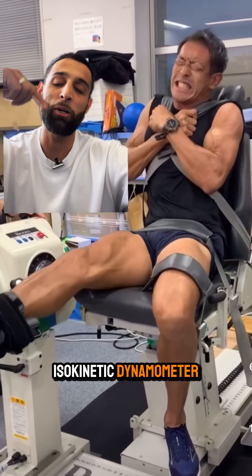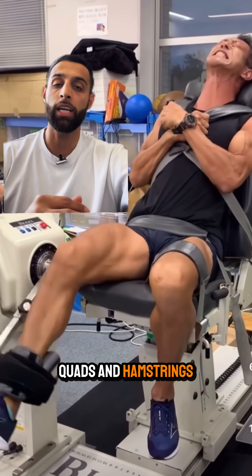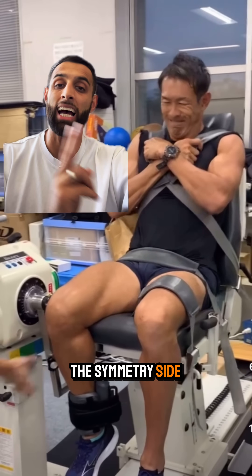This is called an isokinetic dynamometer, and what we use it for is to check force production in the quads and hamstrings before we return somebody to sport, or to check a symmetry index — basically the side-to-side comparison.